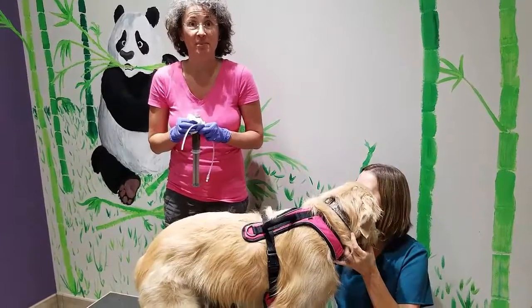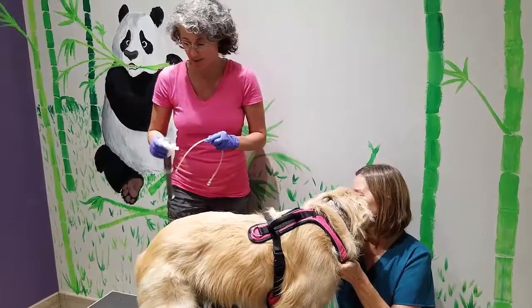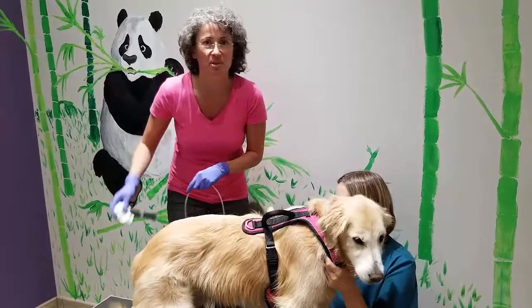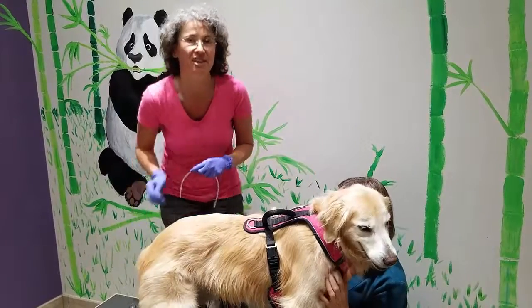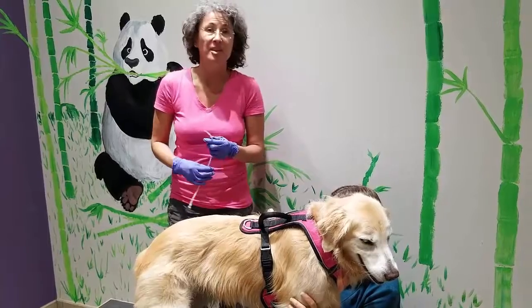I'm doing a fecal transplant on my good friend Willow here. I just want to show you how it works because I get a lot of questions from different people about needing sedation and it being painful or difficult for the animal, but it really is not.